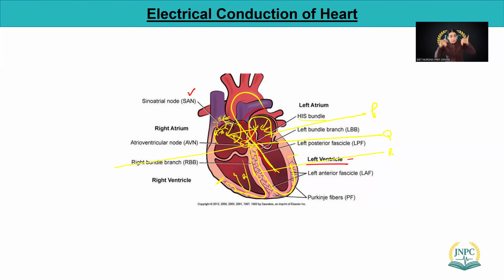And what is happening when the pulse is there, electricity is there, that part is contracting. So when the impulse is coming here, that time R is forming. It's a big pathway they have to travel, right? And that's it. So R is forming.